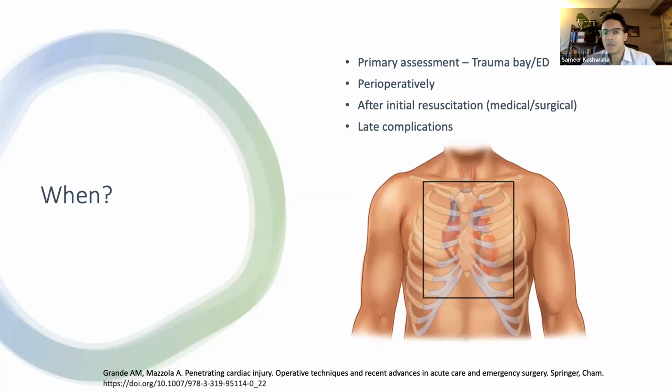We sometimes use echo perioperatively, either in the OR or after the OR, to assess patients. Or most commonly, we in cardiology will see patients after the initial resuscitation, whether that be a medical resuscitation or after they've undergone some surgical procedure to fix other traumatic problems. And then very often we'll also see patients to deal with some of the late complications of traumas.